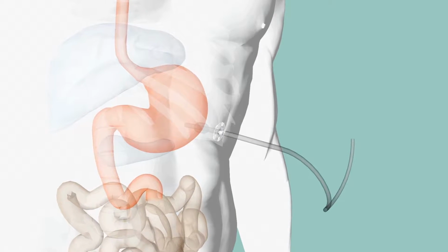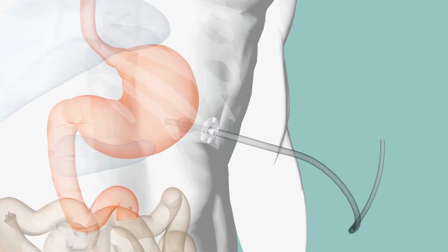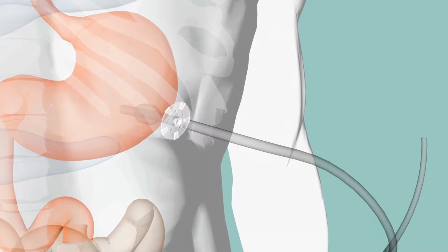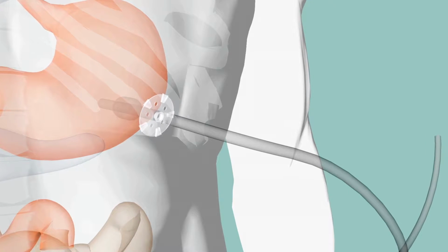A gastrostomy tube is a soft plastic tube that is fed into an opening in the skin and passed through to your stomach. The tube is held in place with a soft rubber disc or flange. The gastrostomy tube can easily sit under a person's clothing and is usually not noticeable.